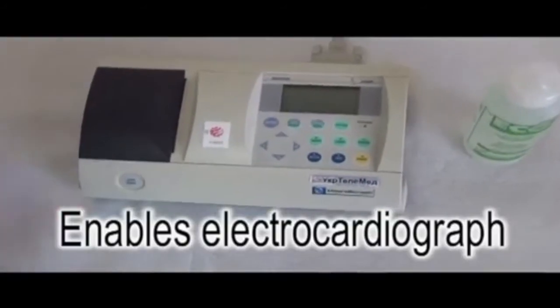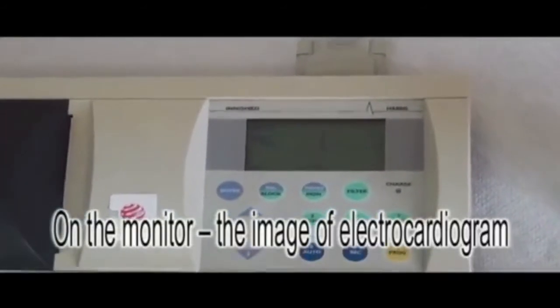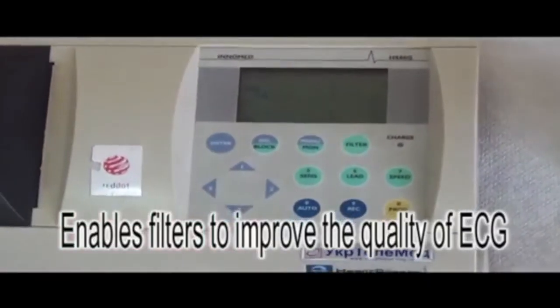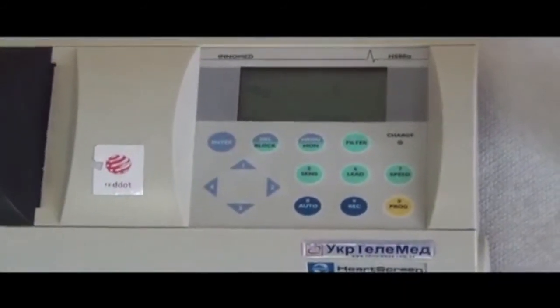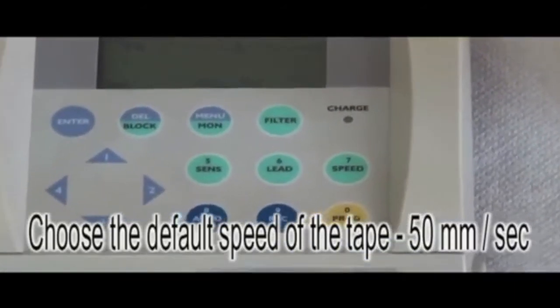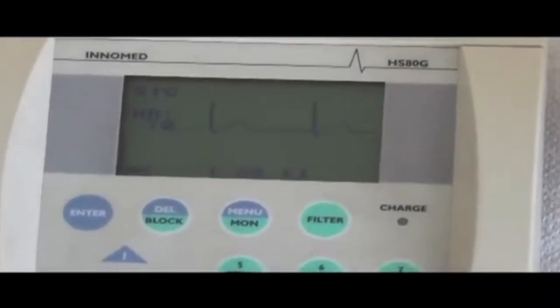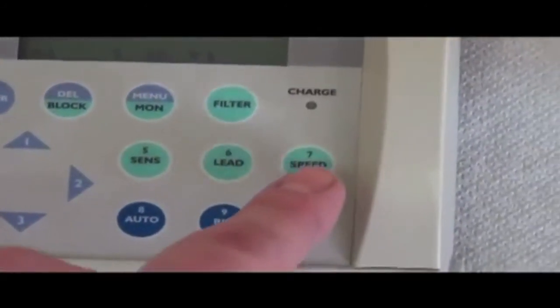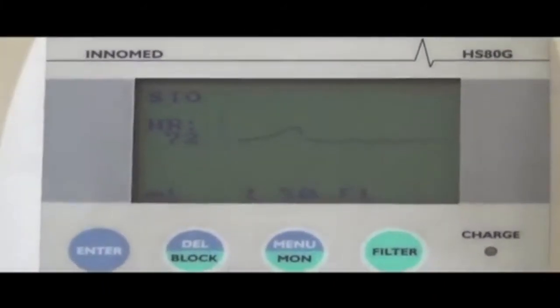Turn on the ECG. On the monitor, you can see the image of the electrocardiogram. We should enable filters to improve the quality of ECG. After this, we should choose the speed of the tape. The standard speed is 50 mm per second. The default setting on the display may be 25 mm, so we should press the speed button and choose 50 mm per second.